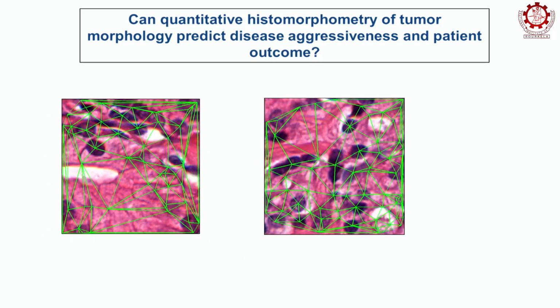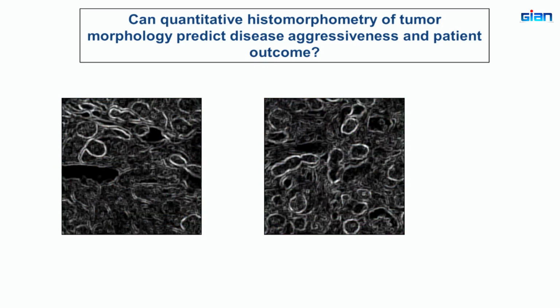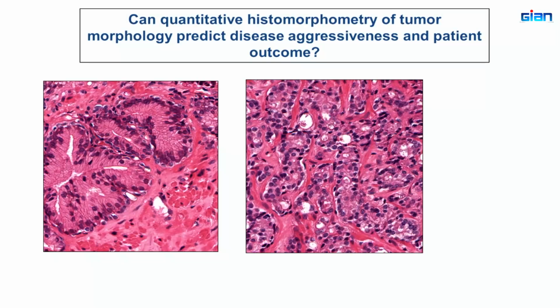So let's go back to the previous slide. Here you can see in detail where the different cells are. Now if you come out one level, you can begin to understand that the region of interest from the previous slide was probably somewhere here, right? So now you do see cells, but you also observe the context. You see what the different kinds of cells around it are, right? So it's much more information as compared to just a small patch.